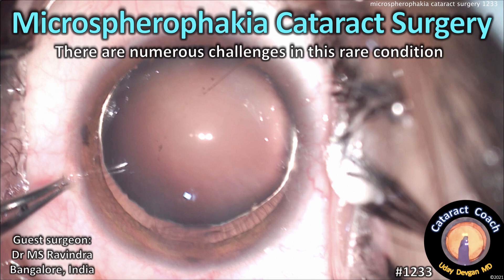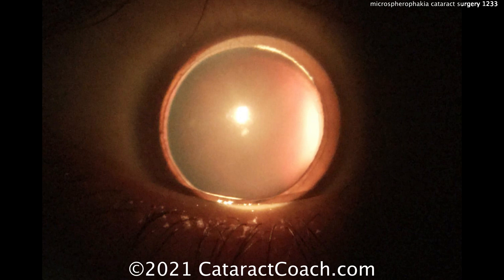CataractCoach.com. Microspherophakia cataract surgery — there are numerous challenges in this rare condition. Dr. MS Ravindra is our guest surgeon. Look at the pre-op exam.